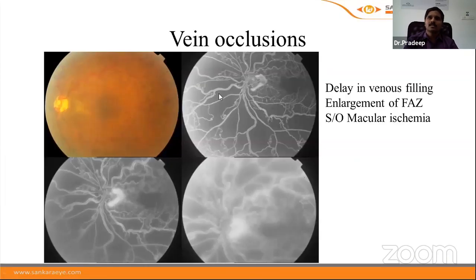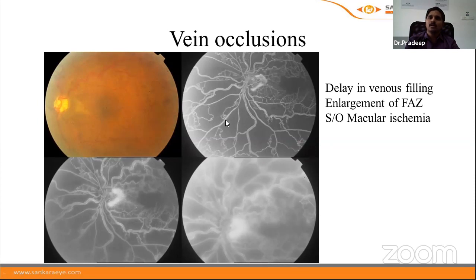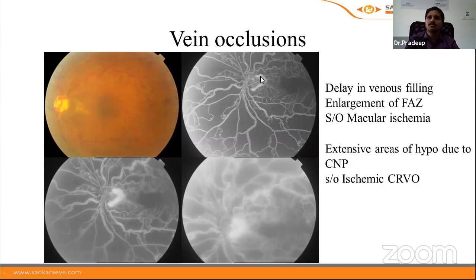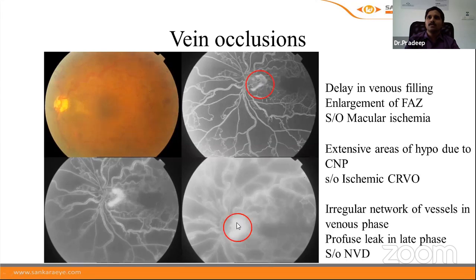In ischemic CRVO on FFA, the foveal vascular zone is significantly enlarged and distorted, indicating macular ischemia. Multiple areas of hypofluorescence due to non-perfusion are present. An irregular network of vessels showing increase in size and intensity over time is suggestive of neovascularization at disc, confirming ischemic central retinal vein occlusion with neovascularization at disc.